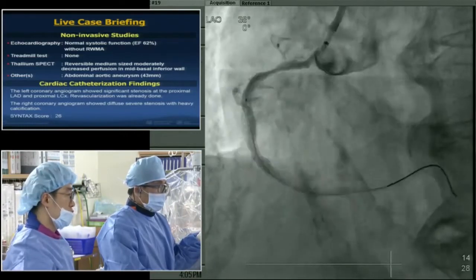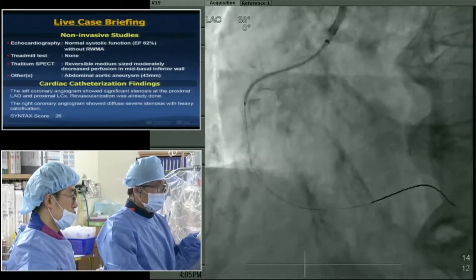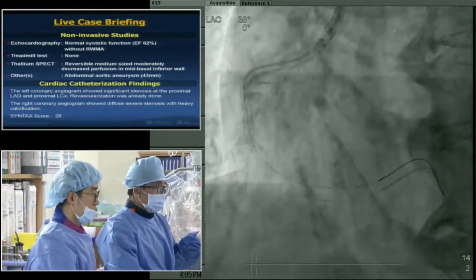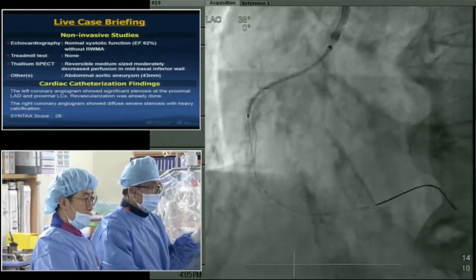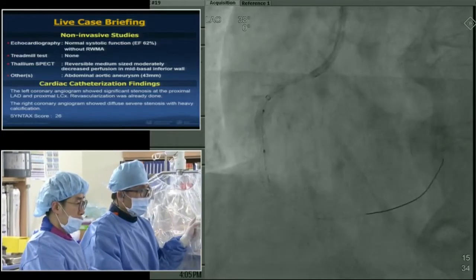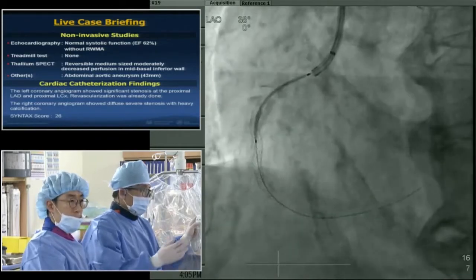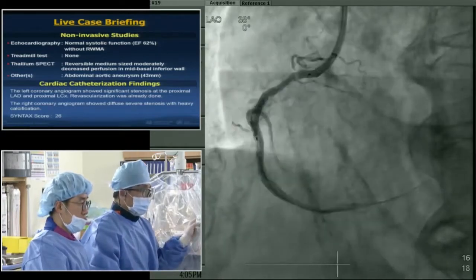And then we tried to use another stent at the proximal. You can see the flow is getting better to the distal. At this time, the patient was relatively stable. Because the stent did not go in, we used another 2.5 balloon and anchored at the distal stent and introduced the Guidezilla like this, and put the Guidezilla tip at the mid portion of the stent, considering the friction occurring when you introduce the second stent at the proximal.